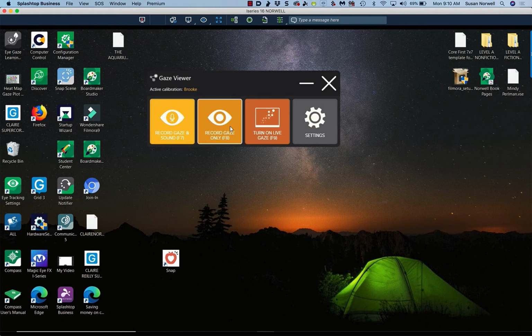If you're recording just the gaze, you're not going to have the context of what the heck they're doing, which is difficult in my mind. So like if you say, oh my gosh, look at that cool dress she's wearing, and the eyes go over to the dress, there's some recognition in terms of language comprehension, but also ability to access that area. So we're always looking at kind of two things.